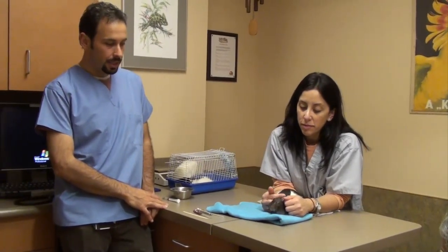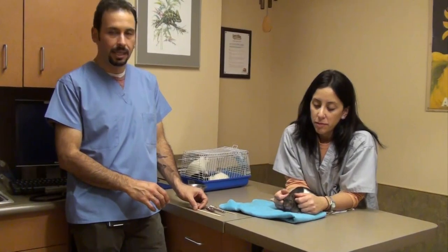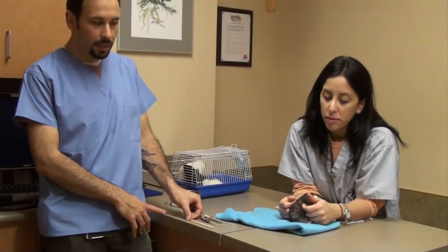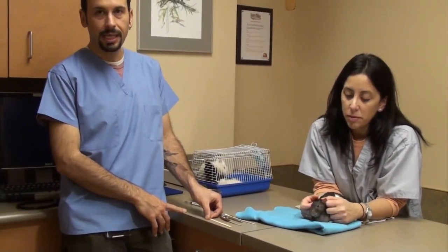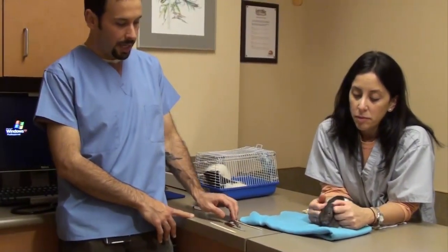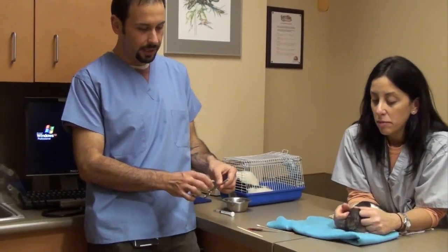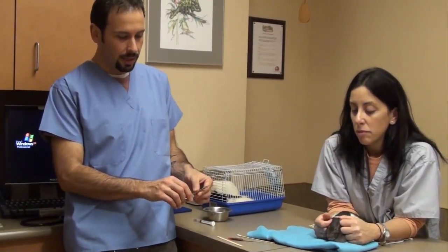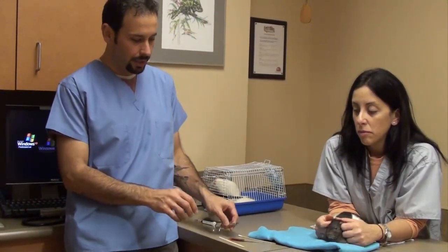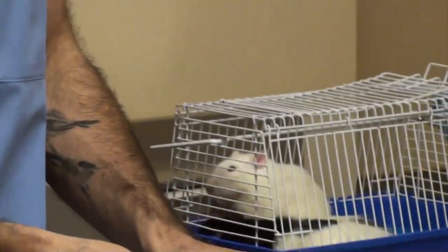You need a couple of pieces of equipment: something to protect the insides of the mouth — the tongue, gums, and lips — so that you're only trimming the teeth and don't accidentally pinch or cut any other tissues. A good pair of trimmers; we use one of these which are available to veterinarians. It's a specific type of cutter that's less likely to cause any damage or fracture to the tooth. And sometimes a good quality nail file just to trim the back of the teeth.